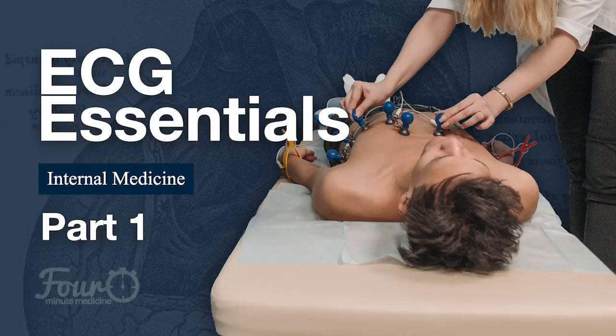This is a recording from the ECG Essentials webinar, where the first 2 steps of ECG interpretation are introduced.